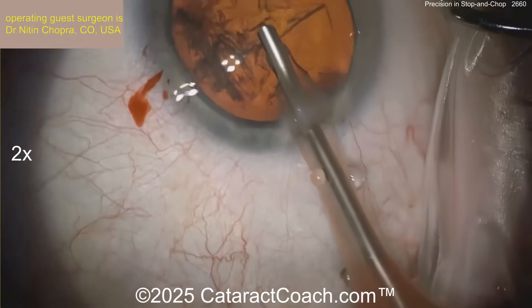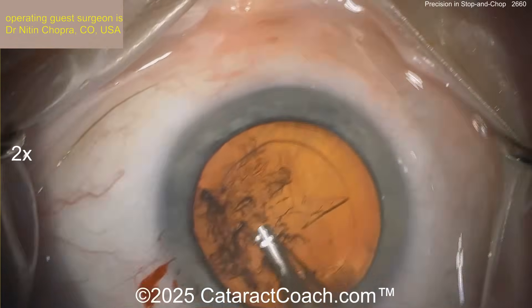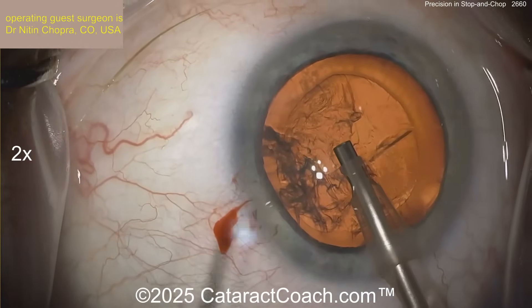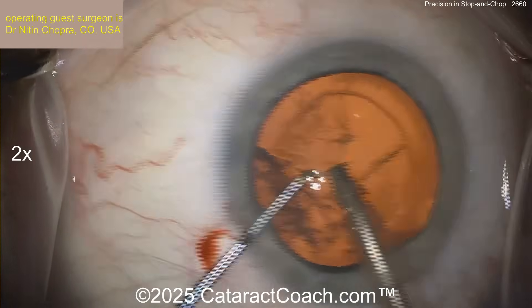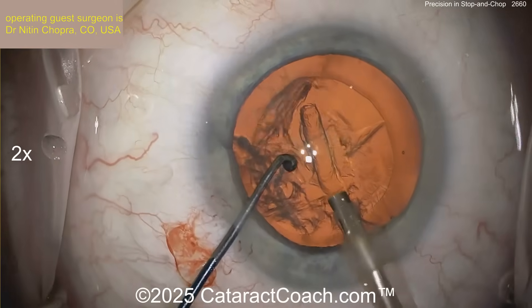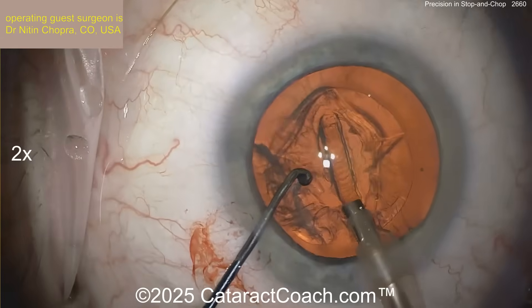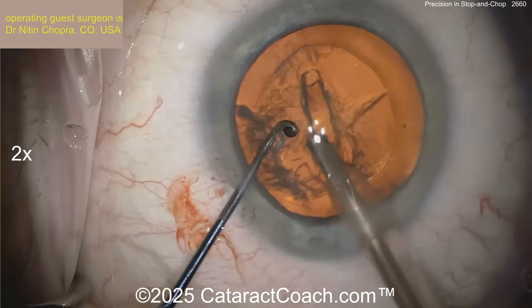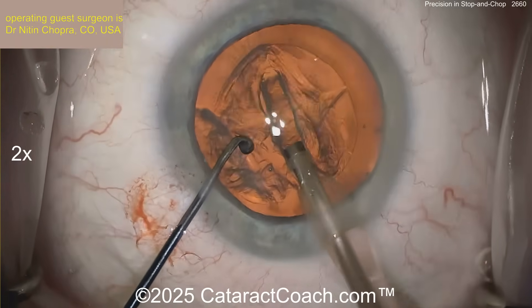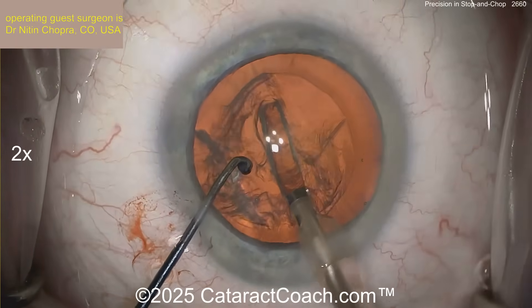We've got the video at two times speed so we can be efficient and watch it in a brief amount of time. Here comes the groove down the middle. This is probably a low flow, low vacuum, and low infusion pressure, with a reasonable amount of phaco energy — for a nucleus like this, maybe around 30%. Nice groove going right down the middle here.